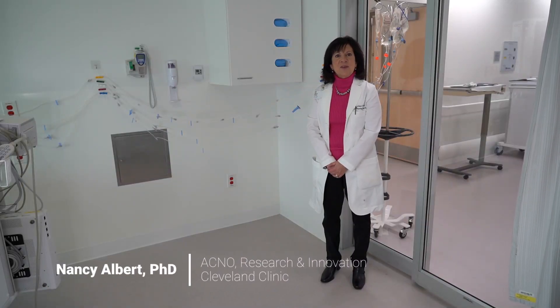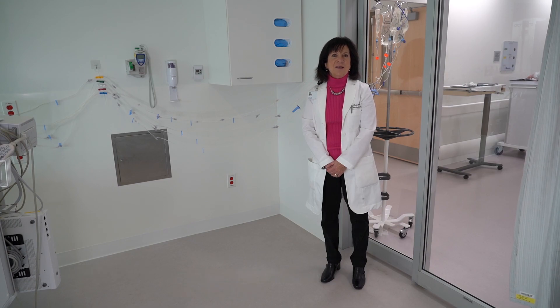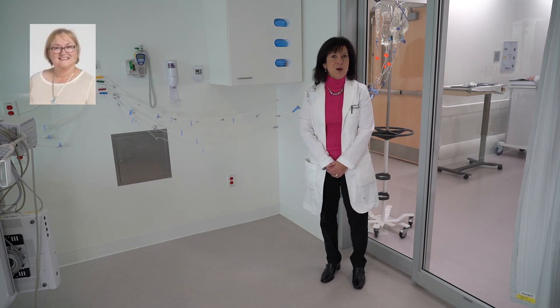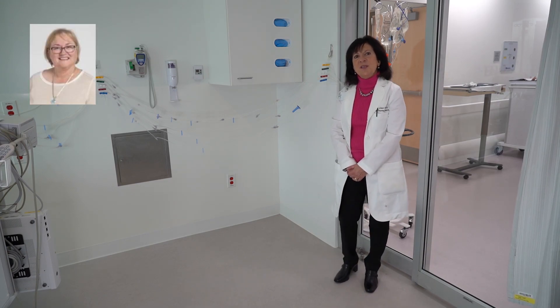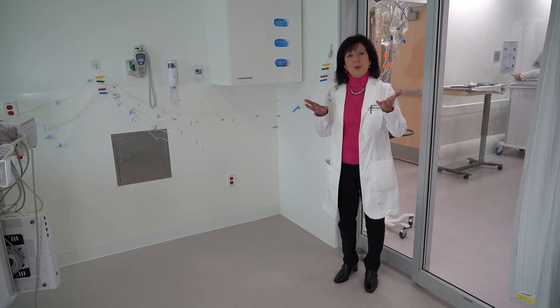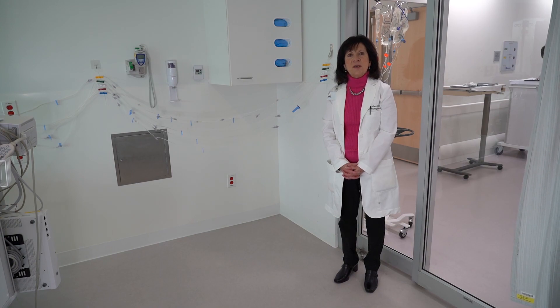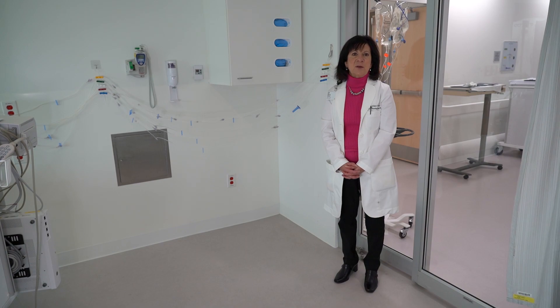Hi, my name is Nancy Albert from the Cleveland Clinic and I'm here to showcase my colleague's innovation. Her name is Jane Hartman and the name of the innovation is HiLine. HiLine is a device that helps lift up IV tubing off the floor when you have a scenario in intensive care with isolation and your goal is to protect or save PPE and you have your pumps outside the door.